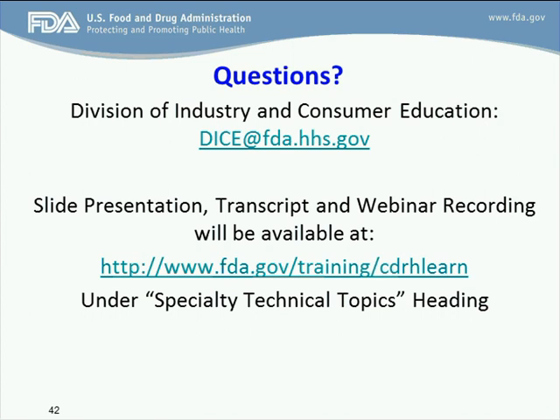That's understandable. And one other thing in addition to that, if you have questions about which one is going to be most or least effective, any validation design plan should really be put together such that you're testing worst case. For example, if the cleaning agent says mix 1 ounce per gallon, you want to design your validation protocol so it's testing worst case. So you want to do 1 ounce per gallon at the most, but really to prove what's going on there, you'll be better off going a little below that.